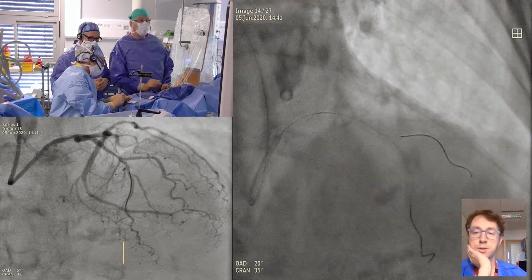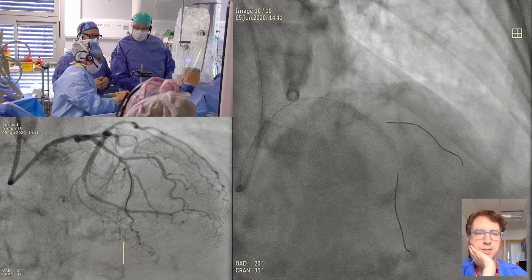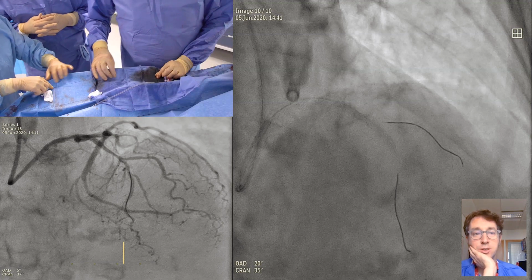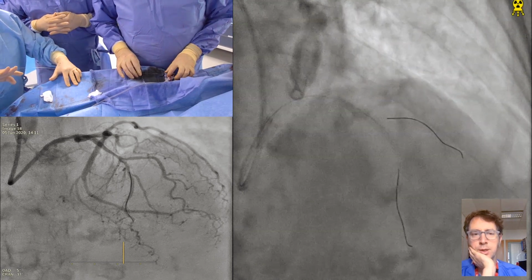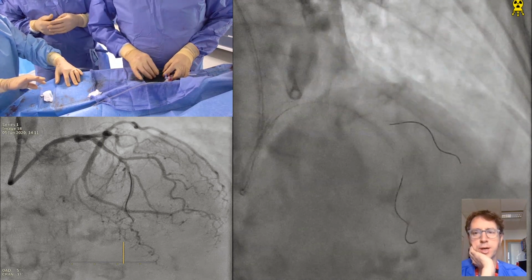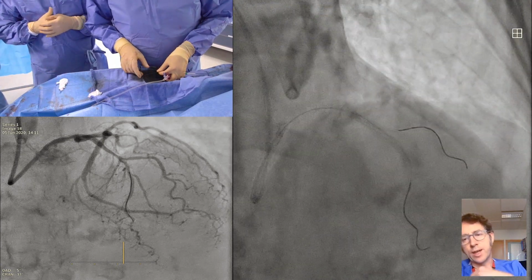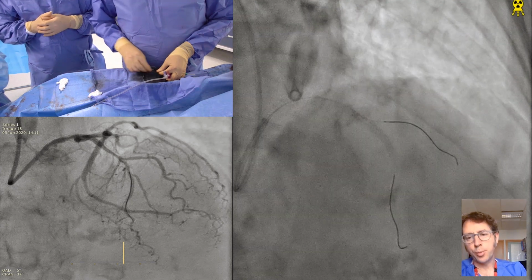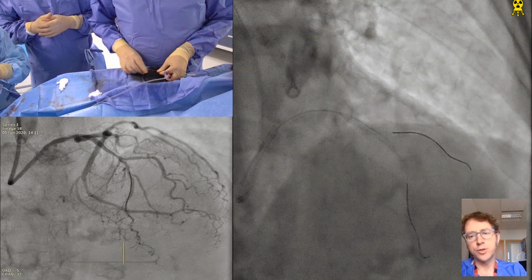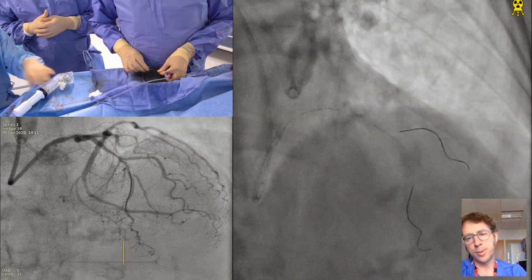Good, and I think it's important to understand that the different stent manufacturers have different expansion capacities. Absolutely. It really is impressive that this 2.25, if needed, could expand to 4.5. Yes, which is by far and away the largest expansion profile that a small vessel stent can provide. So again, in the decision making, ensuring you have adequate length proximal to the bifurcation for your POT, and having considered how big that stent needs to go, are the two essential elements to choosing your stent at the point of preparing the bifurcation.